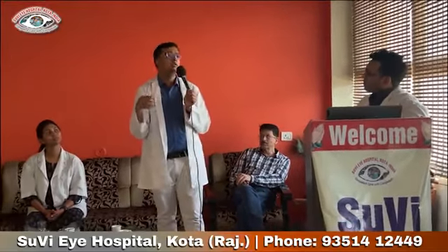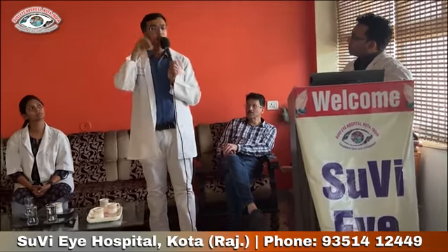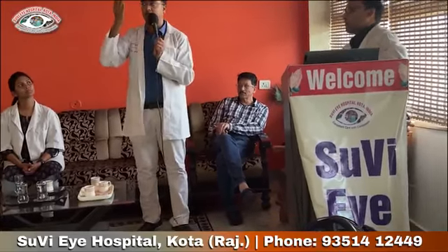And one more important point: the operculum. Sometimes the holes are associated with an operculum. The operculum should not be lasered. The good thing about an operculum is that the vitreoretinal traction is relieved, because the traction has already been relieved and has formed an operculum, but the operculum should not be lasered.